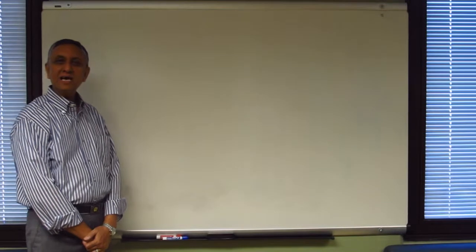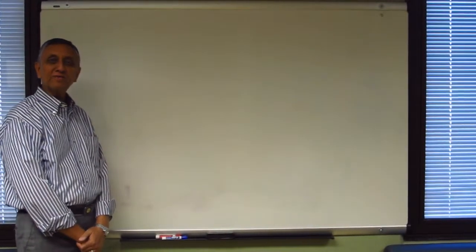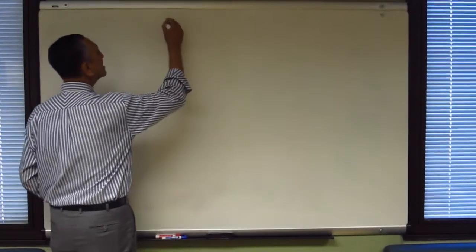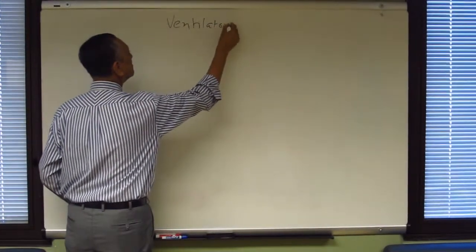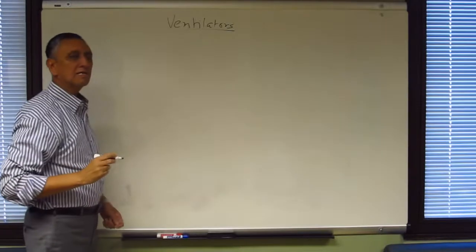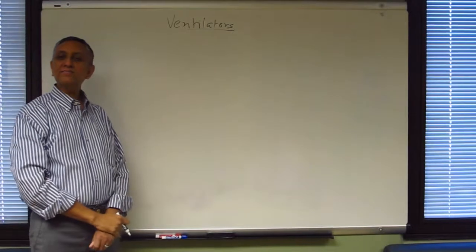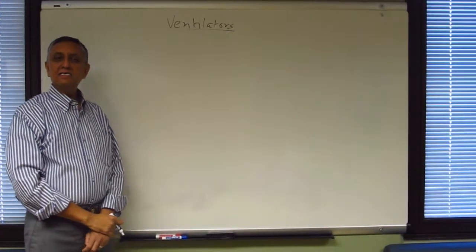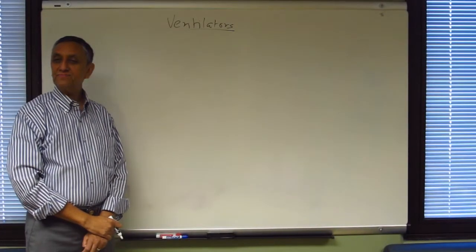Welcome to a talk on ventilators, and I'm going to have a misnomer for you when we finish the talk. Before we proceed, there are some basic questions. Which one was the first ever ventilator discovered? Do you know the name of it? I think you know. It's called iron lung.